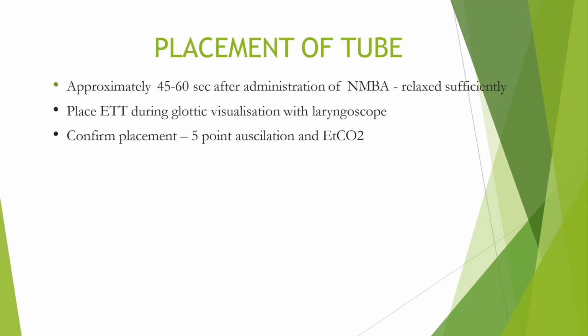Coming to placement of the tube. Approximately 45 to 60 seconds after administration of the NMBA, the body will be relaxed sufficiently. Place the ET tube during glottic visualization with the laryngoscope. Confirm the placement by 5-point auscultation and ETCO2.